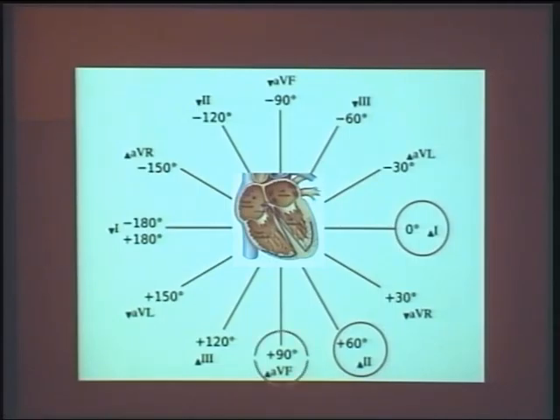Whenever my AVF shows the tallest positive QRS complex, normal axis, 90 degrees, position of the heart, vertical heart. You understand? So even in the normal axis, you decide whether it is L2, L1 or AVF depending upon 0 degrees, 60 degrees and 90 degrees: horizontal heart, intermediate heart or vertical heart. So once you decide normal axis, you have to decide these three things.